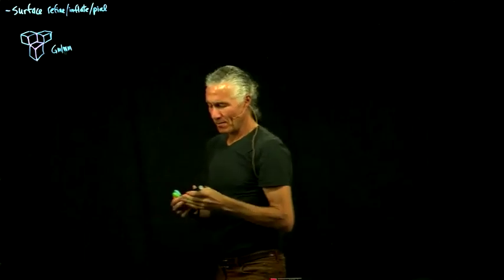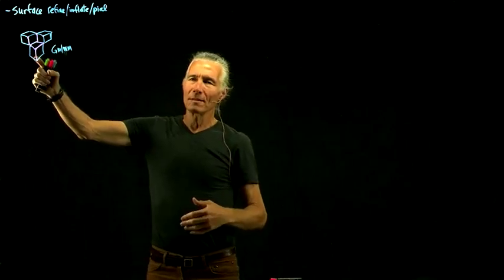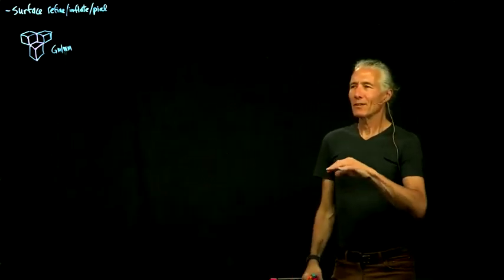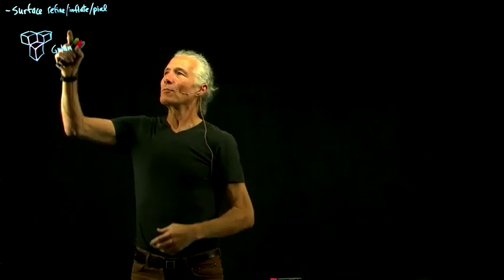Then you have this very lumpy surface. It's just the faces of these voxel cubes that you identified as white matter. That looks kind of jaggedy, so what we want to do now is refine it and do various things with it.